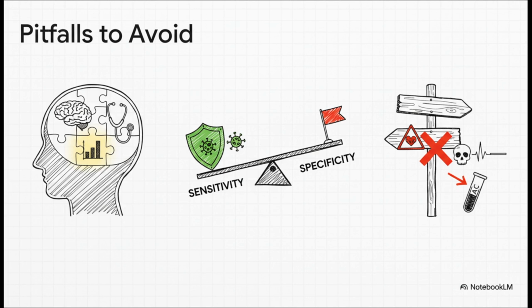And finally, do not mistake it for a prognostic marker. An elevated MDW tells you about the risk of sepsis, but it does not predict mortality or how sick the patient is. That's what your lactate is for.